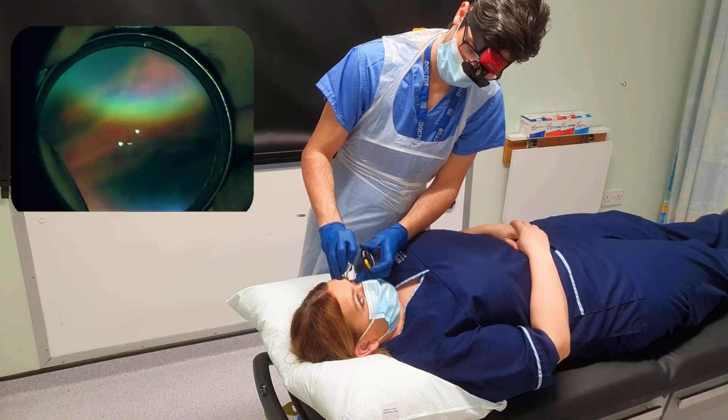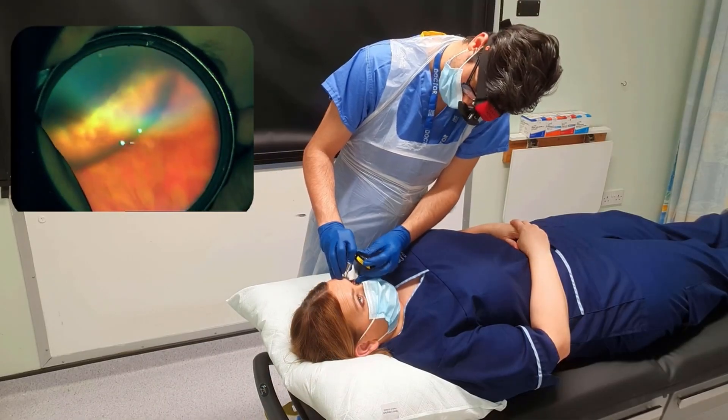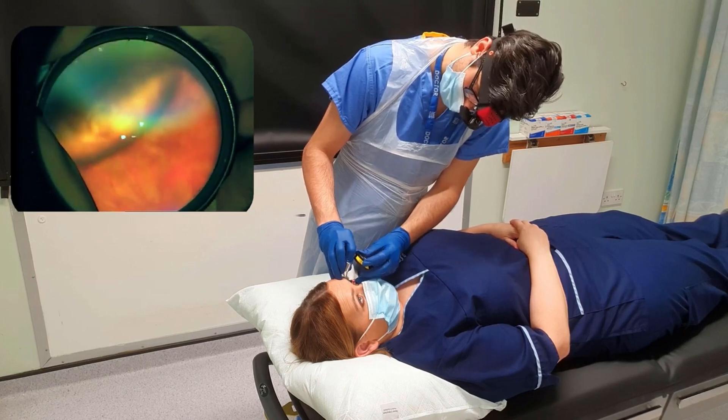When scleral indentation is used, you can also get quick and dynamic views of the far periphery of the retina. This is important in patients complaining of flashes or floaters who may have developed a retinal tear, as well as premature babies for judging the stage of retinopathy of prematurity. Another big benefit of the BIO is that it allows a good view of the retina despite media opacities such as corneal scarring, cataract, or even blood in the vitreous.